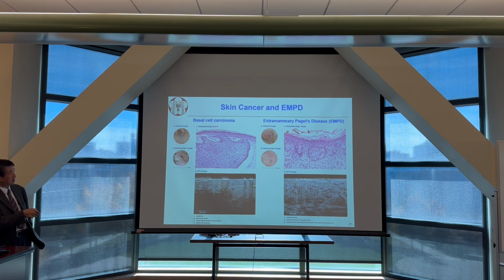This is for the cancer. Actually, we have this clinical trial. We recruit about 400 patients in Taiwan. Only about 5 to 10 patients really have basal cell carcinoma. So in Taiwan, this is really not something popular. And for this EMPD, it's also a malignant tumor. We have several patients, so we collect this kind of data.